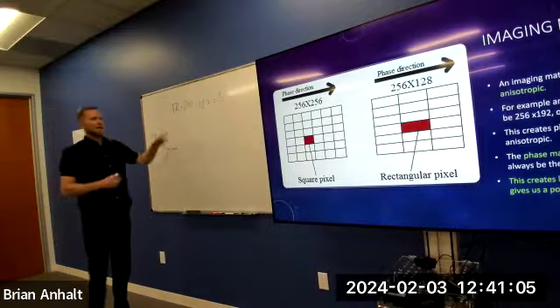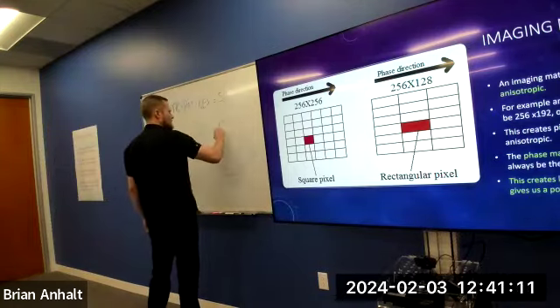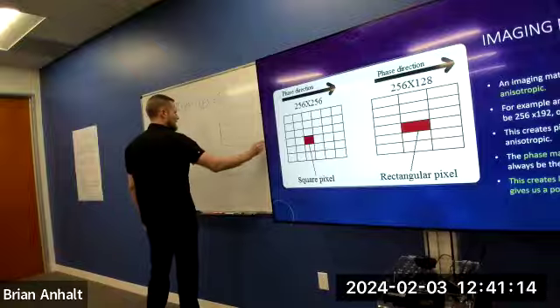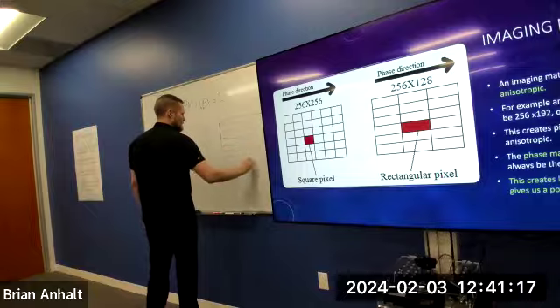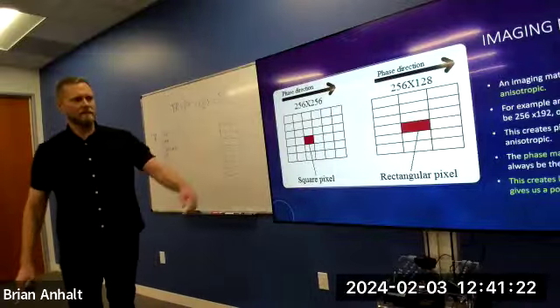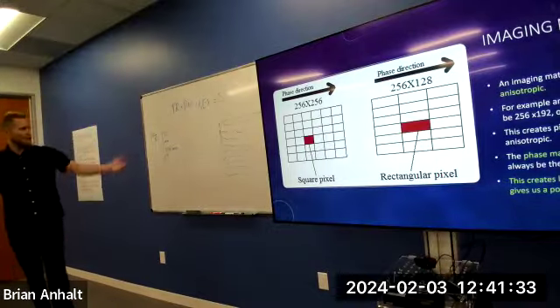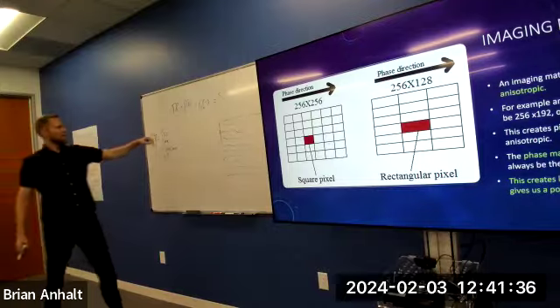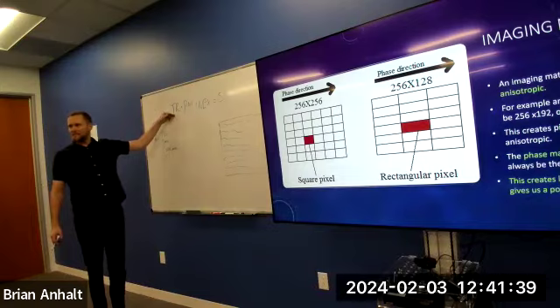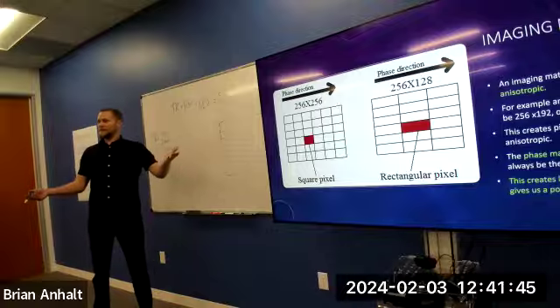The reason this affects scan time is because it has to do with k-space and resolution. Remember, k-space has a bunch of lines. We have to fill all these lines with an echo, right? The number of lines we have to fill is determined by phase matrix. So the amount of echoes that I have to collect to get that resolution is determined by the phase matrix. I collect one echo per TR, right? So the time it takes me to collect that many echoes is going to be my scan time.